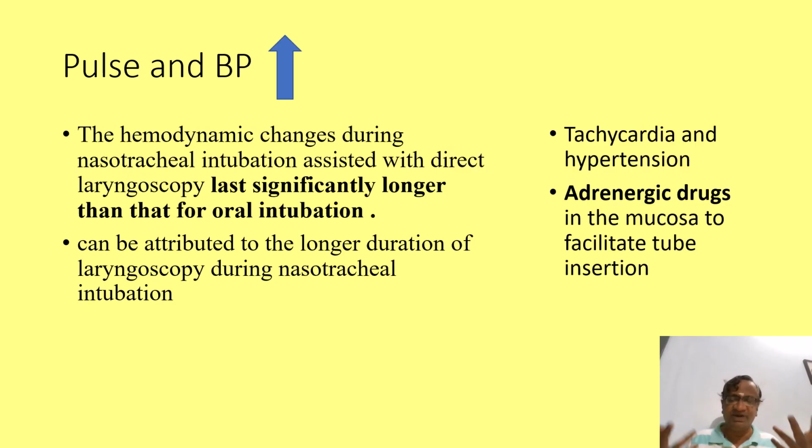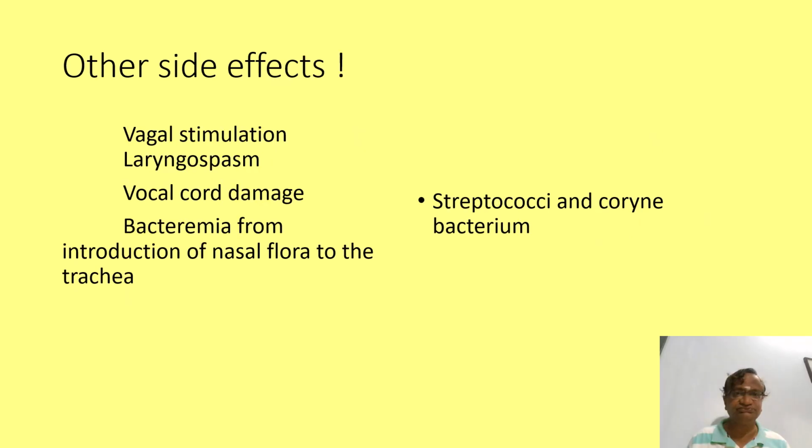Yes, it's an intubation. Pulse and BP are going to rise. Sympathetic stimulation is going to do that, plus laryngoscopy and intubation. Other side effects may be vagal stimulation, spasm, vocal cord damage, bacteremia from introduction of nasal flora, streptococci and corynebacteria.